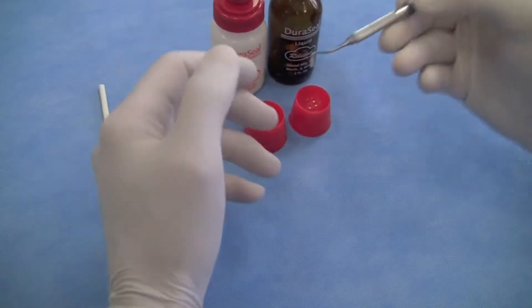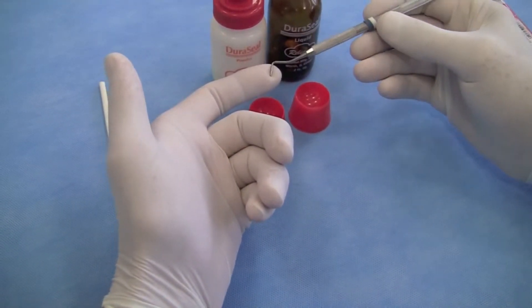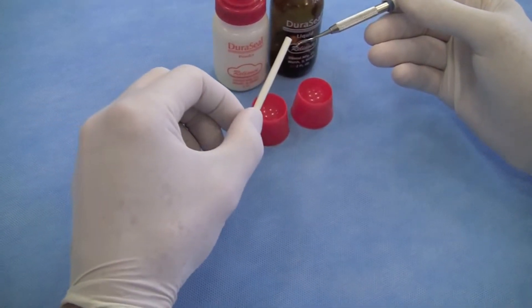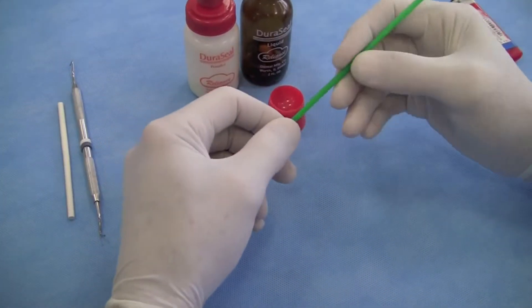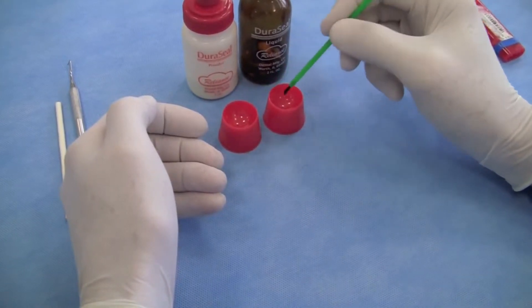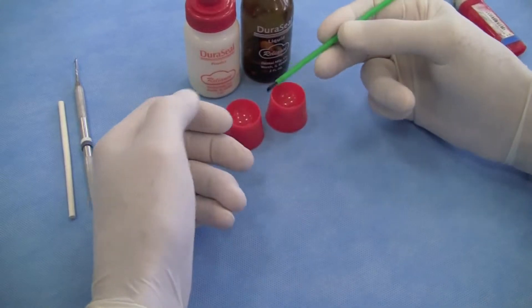We'll also need some kind of placing instrument — a condenser or a cord packing instrument — to place the small piece of warm Gutta Percha into the box area. Then we'll use a brush, dipping it quickly in the liquid and powder, to apply the covering of Duraceal over the surface.